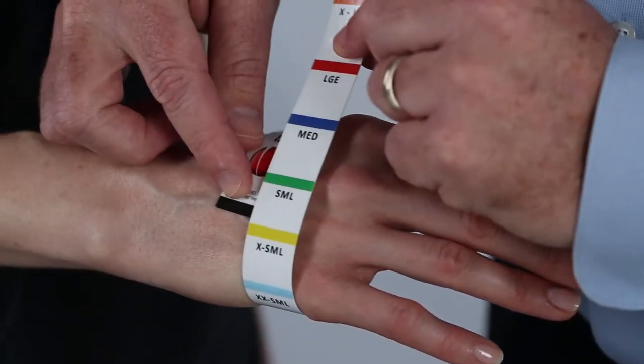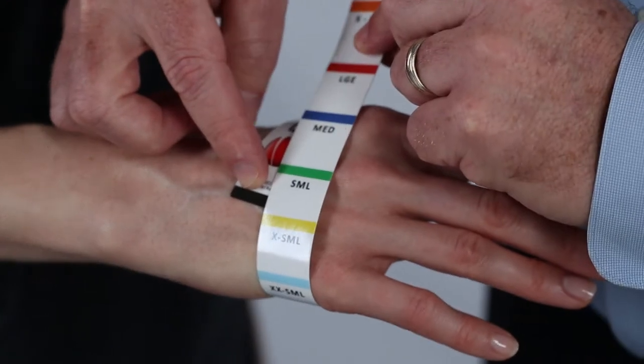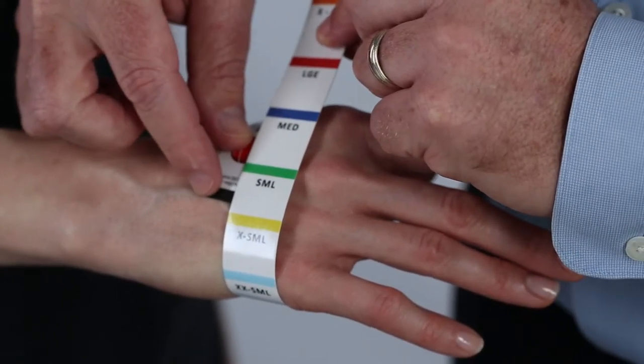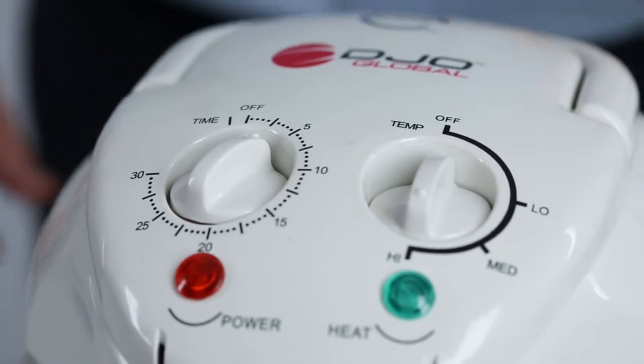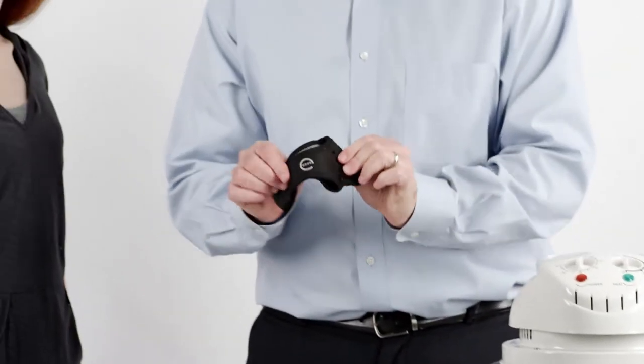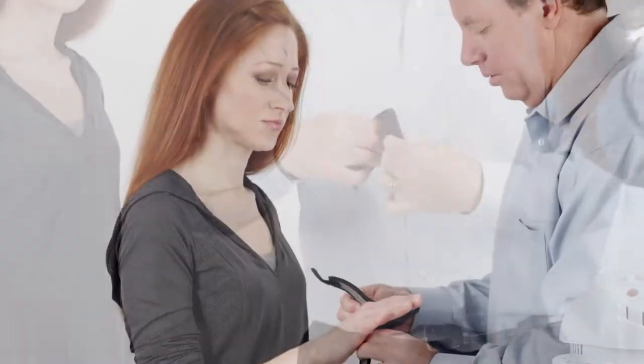Application of the Short Thumb Spica 2. Use the Exos measuring tape to select proper brace size. Heat the STS-2 for 3 minutes. Refer to the instructions provided with that oven for heating instructions.